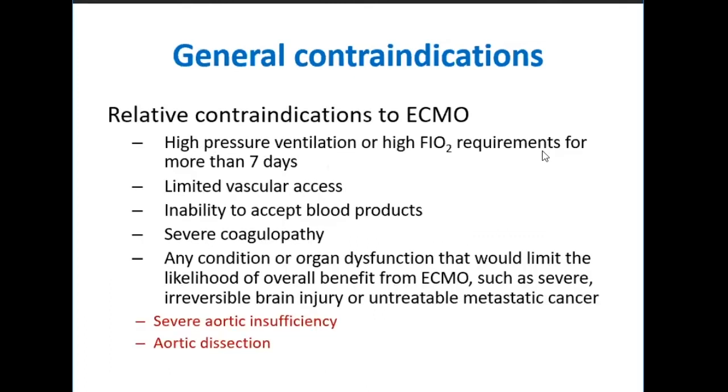Relative contraindications are high pressure ventilation with a high FiO2 for more than 7 days in ARDS patients, limited vascular access, and inability to accept blood products. There are certain conditions where the patient is not in a condition to accept blood products, because ECMO is a situation where you use a large amount of blood products. Any condition where there is organ dysfunction or multi-organ dysfunction has set in is also a contraindication.